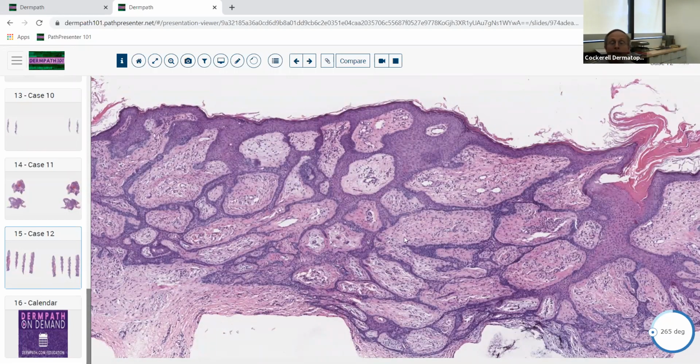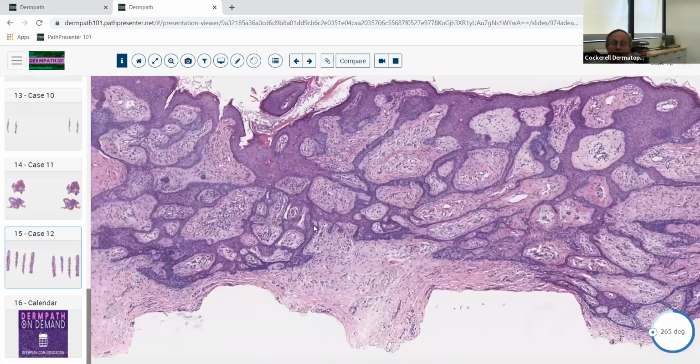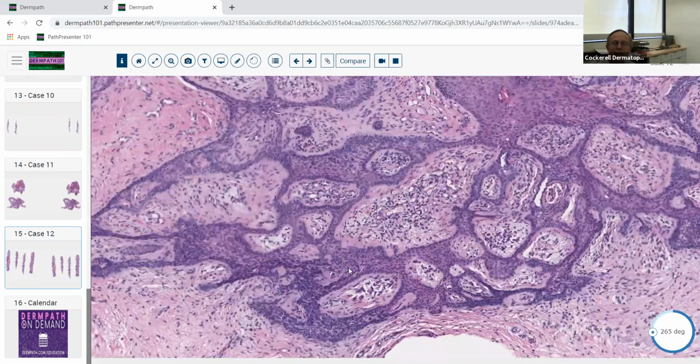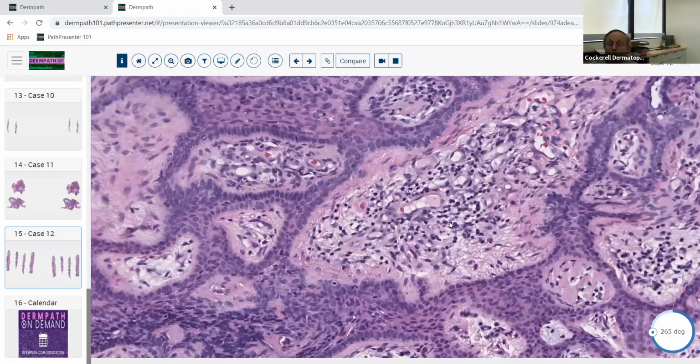Sometimes you see little areas within the lesion that look pretty much like classic basal cell carcinoma, but a lot of times you see these little primitive follicular structures. So these lesions probably are not exactly like basal cell carcinomas, though they tend to get treated like them. Clinically, they look like a skin-colored dome-shaped papule, often on the trunk or back. When you biopsy them, they don't feel mushy like a basal cell. They feel more fibrotic, which you would expect because of the prominent fibromucinous stroma.